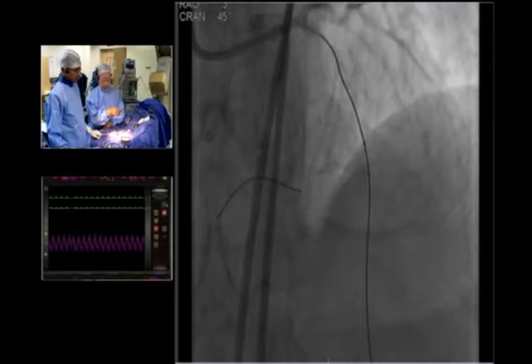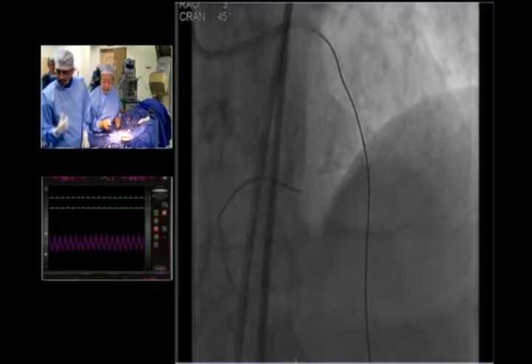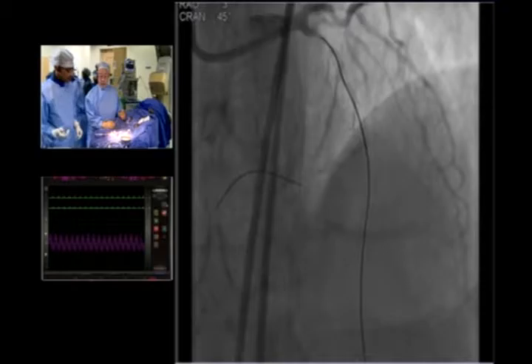Somebody has a good idea to overcome this situation. Maybe I try to place one more wire parallel to this device. Yeah, I would put a parallel wire down it and see if it goes any further, and then you can maybe put a balloon alongside that. XTA, please. Wire could pry that apart.